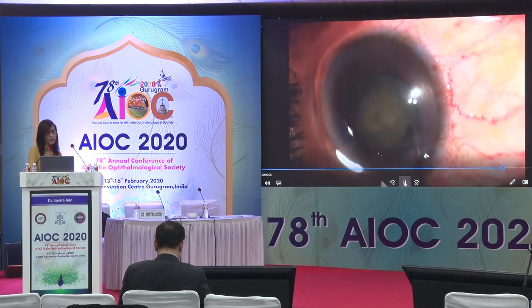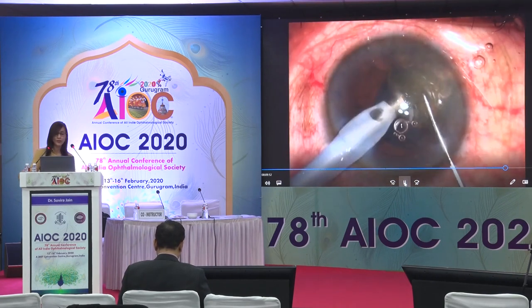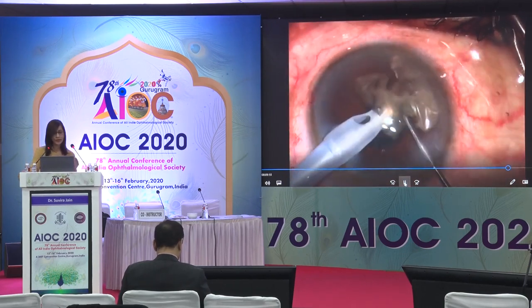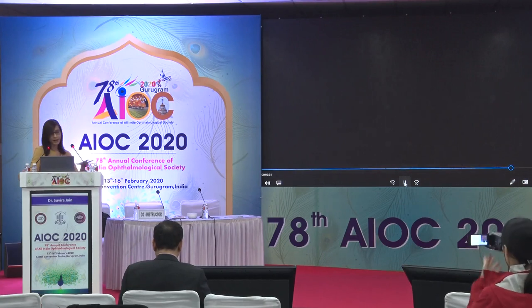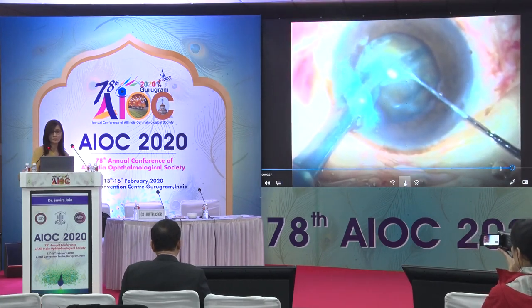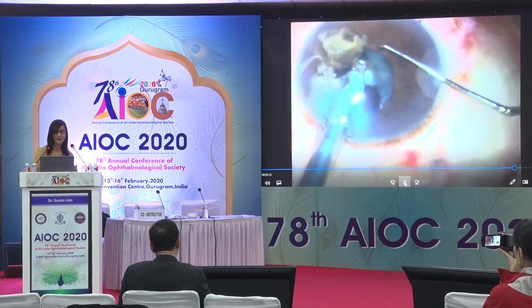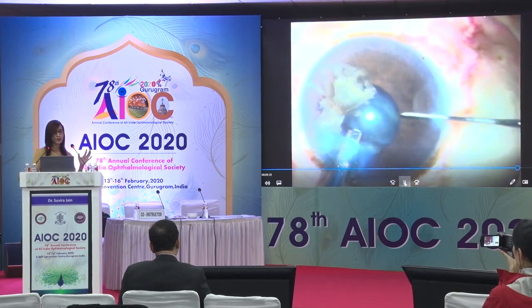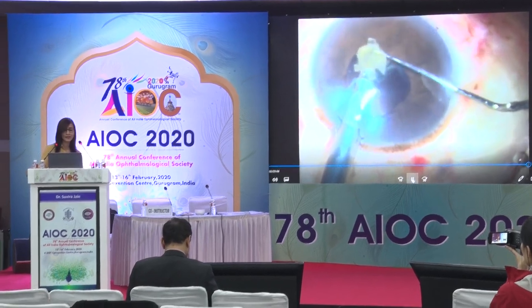The next case shows a pupillary snap happening — the surgeon notices in this grade 3 polar cataract that the nucleus seems prone to dropping. The surgeon brings the nucleus into the anterior chamber, though today I would suggest this is not ideal because of the corneal endothelium — it's best just letting it drop and managing it later. In a hard grade 3 cataract where the last fragment starts to sink, you don't go after it. Put in dispersive viscoelastic and emulsify the last bit of nucleus, then do a visco-BSS exchange.